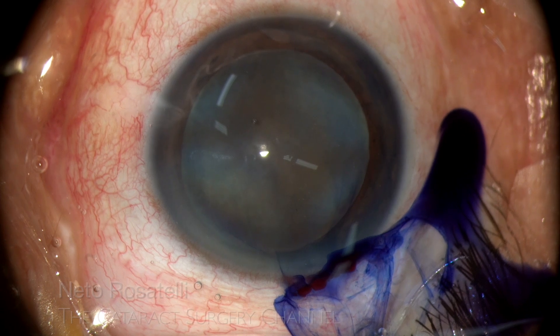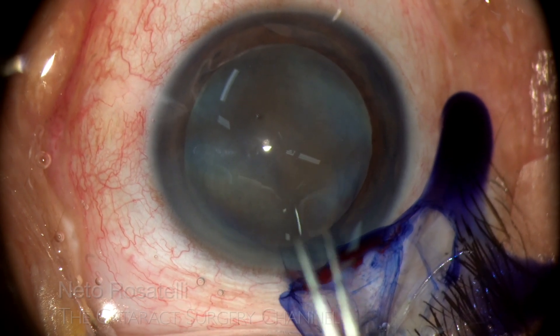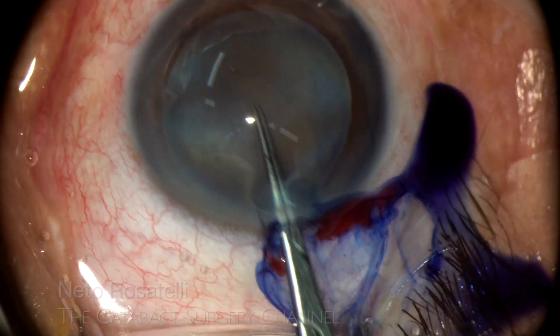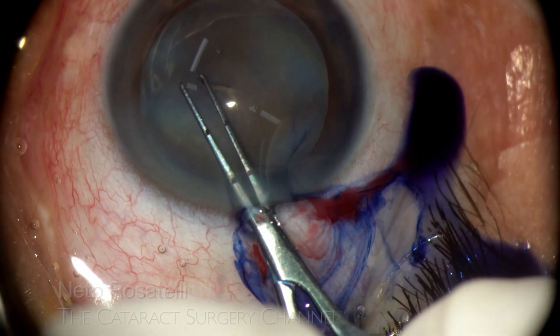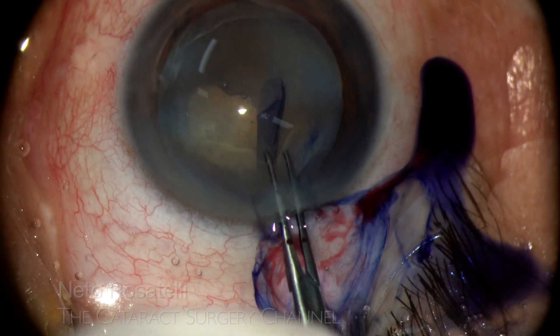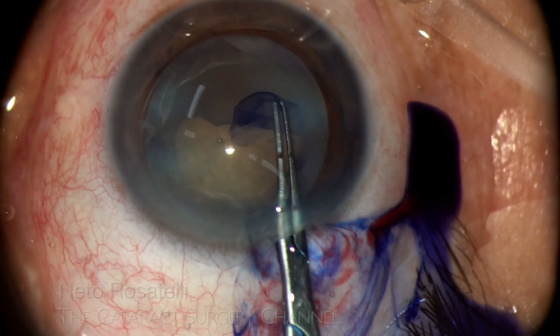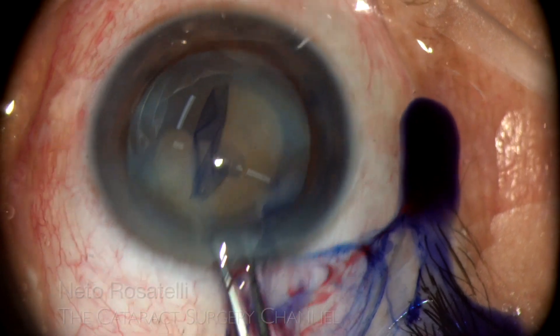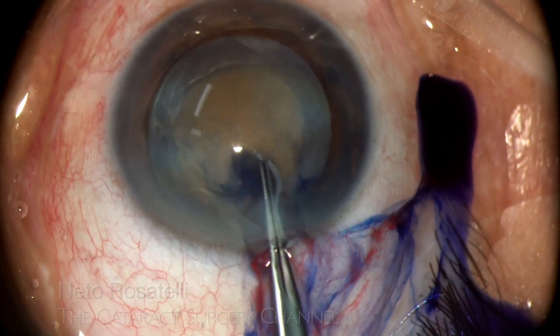Even though this will be a long video, I decided to edit out only the idle time so as to show more of the events and technique and have a little more time to comment on things. In hard cataract cases, it is wise to perform a rhexis more to the large side, like in this one, done with an engraved Inamura forceps to about 5.5mm in diameter.